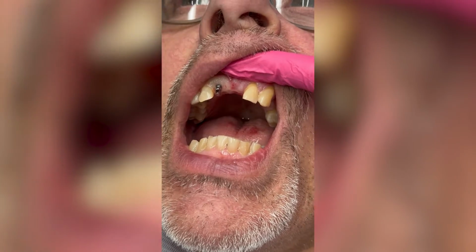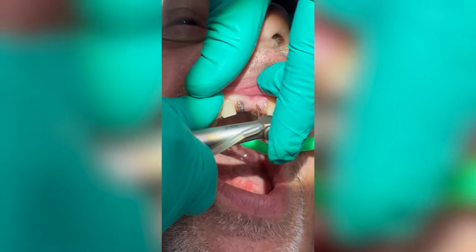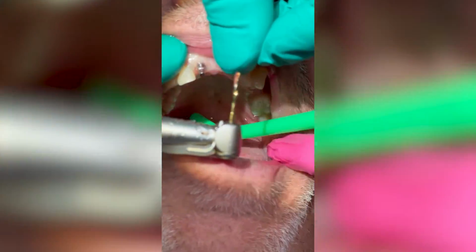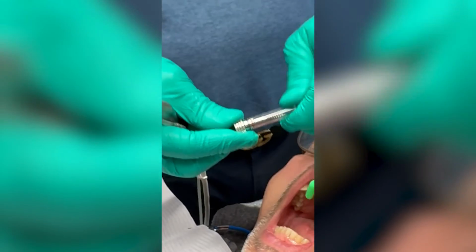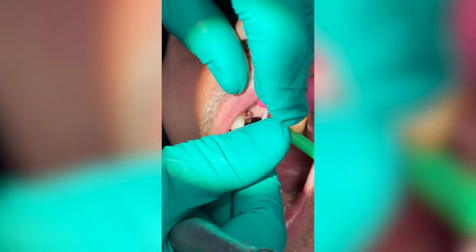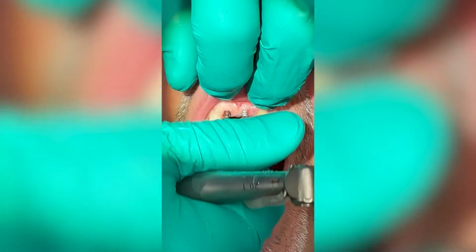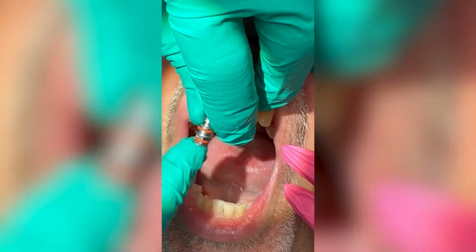So again, we're going to use the 1.5 millimeter pilot drill. And whenever you see bone on the pilot drill, that's a good sign. Okay, so now we're going to go ahead and take our next implant out of the sleeve. And we're going to go right into the patient's pilot hole where we made. And then take that carrier away, and again, this is the disposable one with the 2 rings.